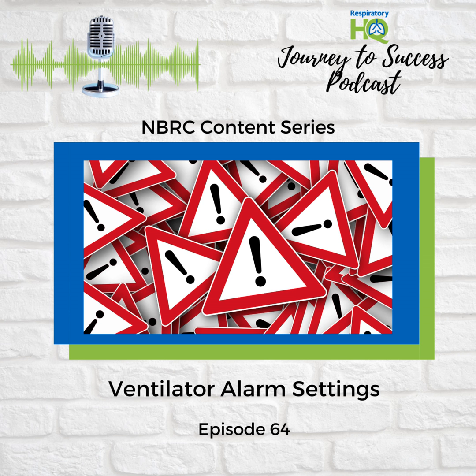Wow. Okay, let's just take a breath ourselves there. That's quite a list of alarms, but it's also incredibly clear how each one targets a specific potential problem. It really is. And what's also quite clever, I think, is how they often work together. A single problem, like a major leak, might trigger the low tidal volume alarm and the low inspiratory pressure alarm and the low PEEP alarm, maybe all at once. So you get multiple alerts pointing towards the same kind of issue, a layered approach. Exactly. It provides confirmation and a more complete picture for the clinician trying to troubleshoot quickly.